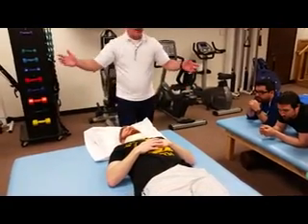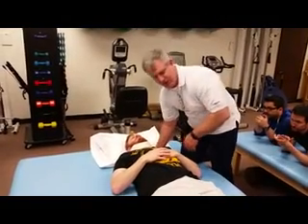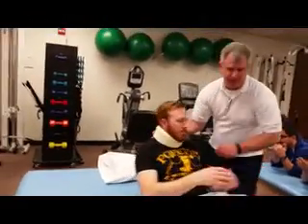And then he can sit up. And then I could help him sit up because he's probably weak and deconditioned. But I would come underneath and try to support, and he can come up.